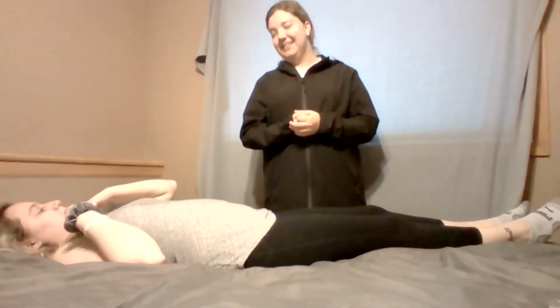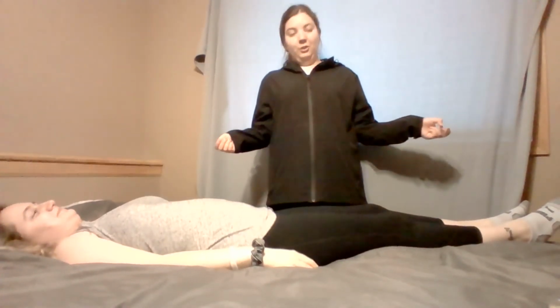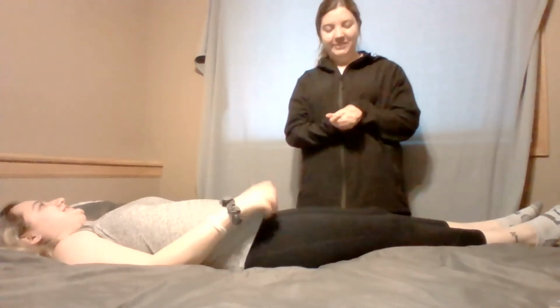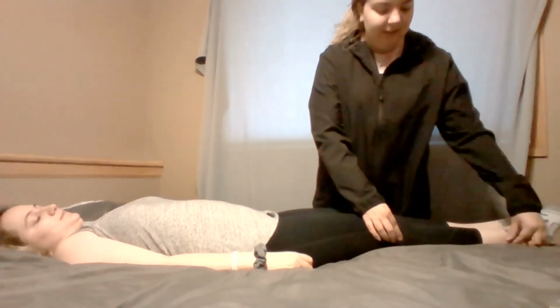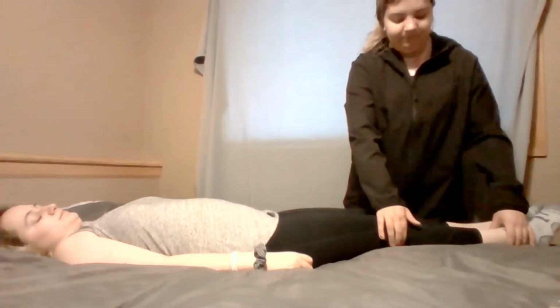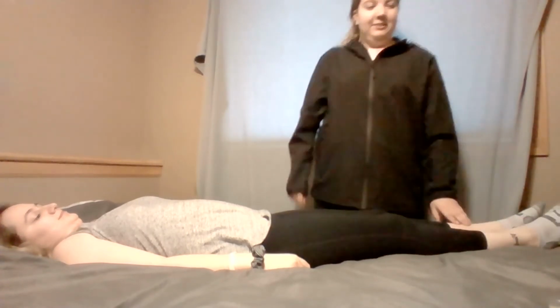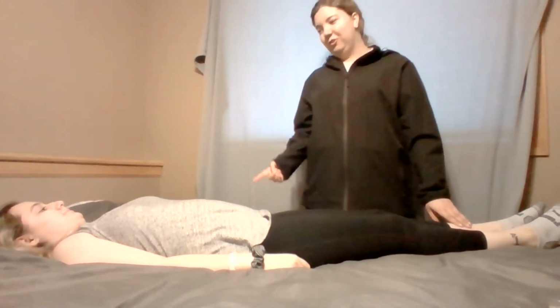Next up, I will have her lying supine for a knee extension range of motion. The axis of rotation is the lateral epicondyle of the femur. The stationary arm is aligned to the thigh, and the mobile arm is aligned to the lateral malleolus. The plane of motion is the sagittal plane, and the normal range of motion is 0 degrees. And from what she demonstrated to me, she also got 0 degrees.